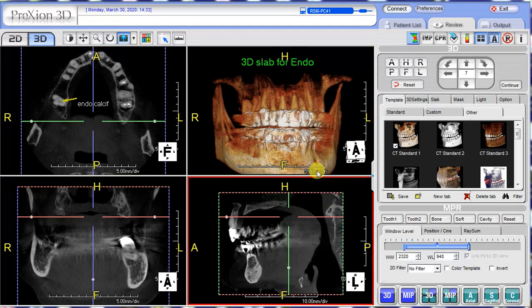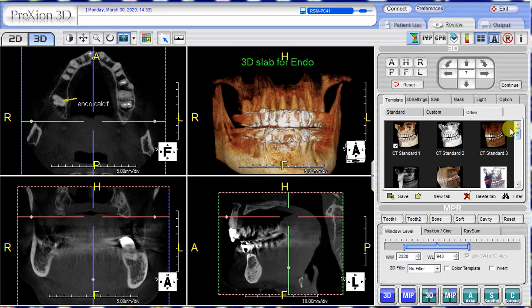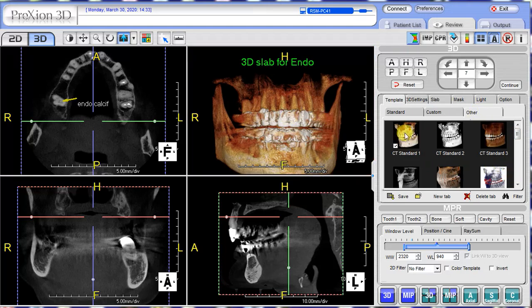The standard 3D templates reside in the right panel. Press the other tab to select the CT standard one as the recommended template. You can use other templates, but this one is recommended.